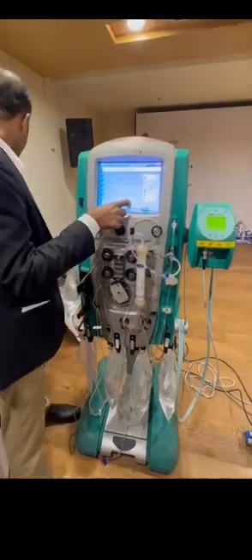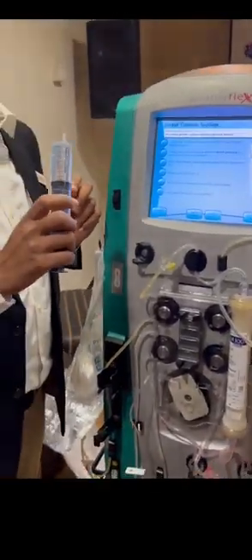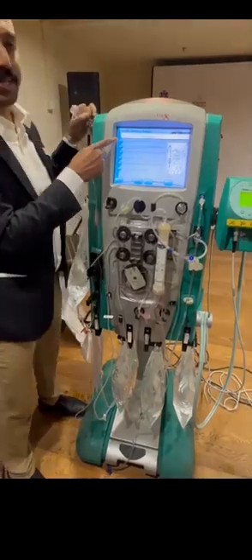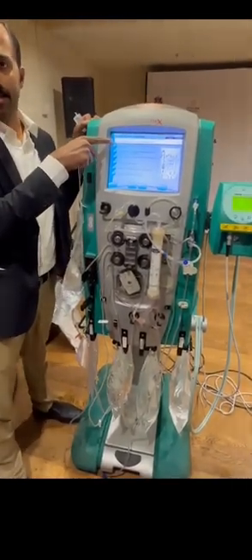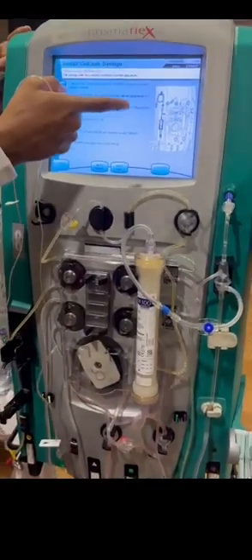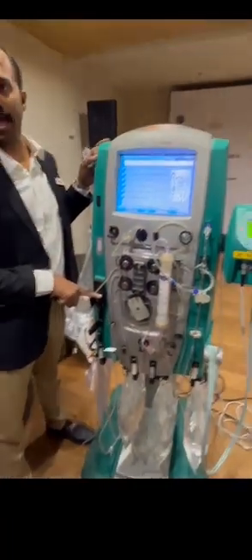Okay, now it is asking for the calcium. If I am using the external calcium syringe pump, this step will not come; it goes directly to the priming. Now we have selected the Prismaflex syringe pump for the calcium infusion.